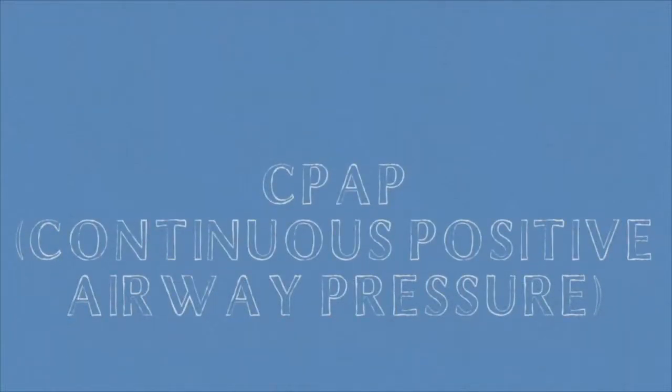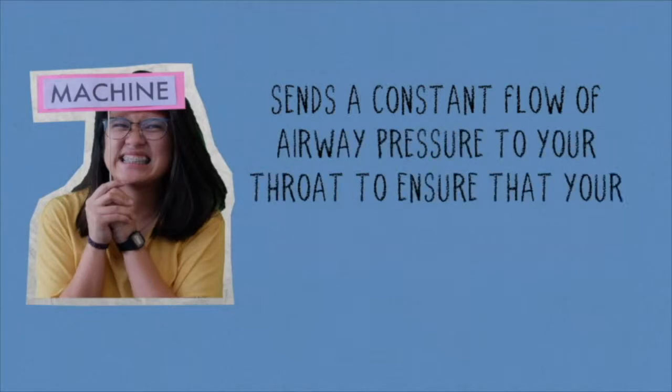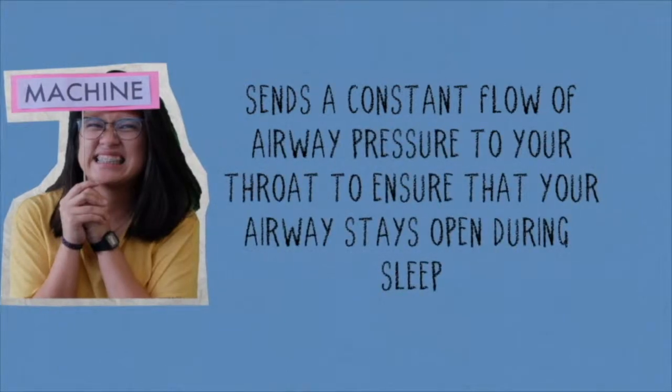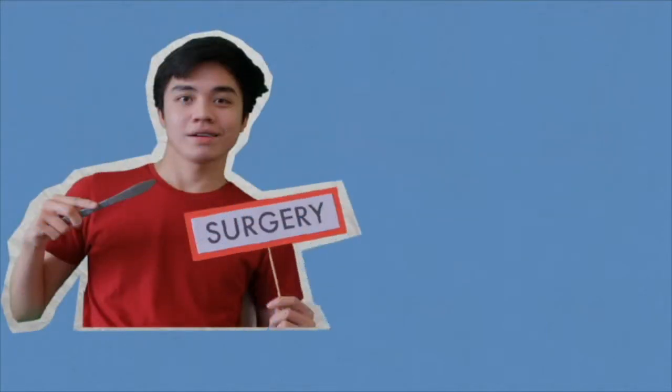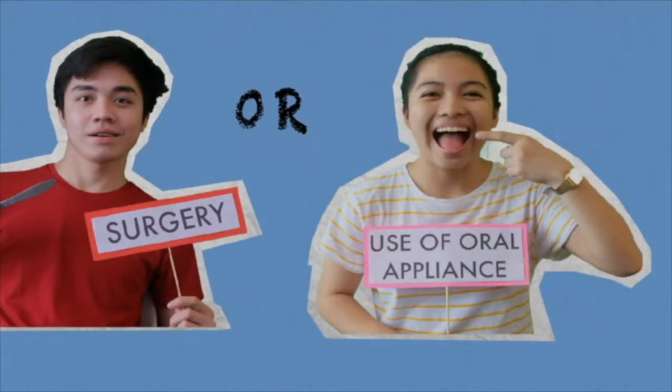There's actually a thing called CPAP, or continuous positive airway pressure, which is a machine that sends a constant flow of air pressure to your throat to ensure that your airway stays open during sleep. Unfortunately, there are lots of people who cannot tolerate CPAP therapy and decide to use other treatments like surgery to the airway or the use of an oral appliance.